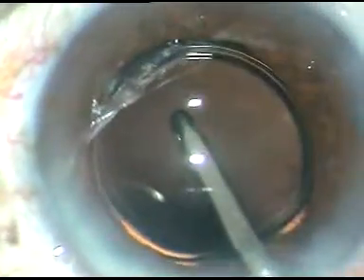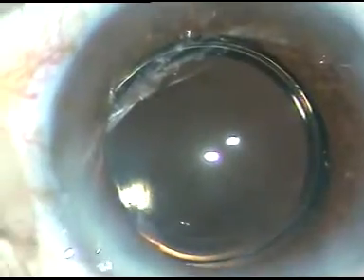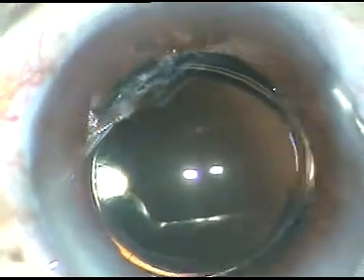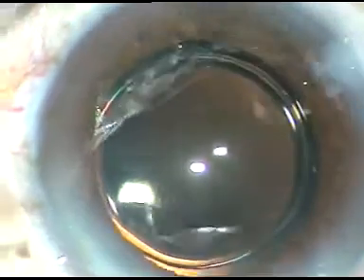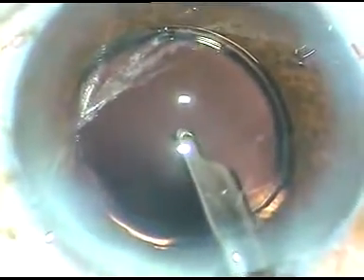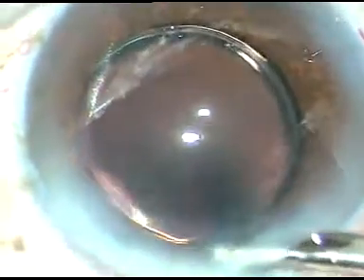This lens is from Apa-Sami Associates. This is moxifloxacin. I hydrate the side ports with BSS — balanced salt solution. After hydrating the side ports, a final massage is given so that the ports are sealed with BSS. I don't want any particles in the anterior chamber — just remove it and conclude the case. Thank you very much for your attention.